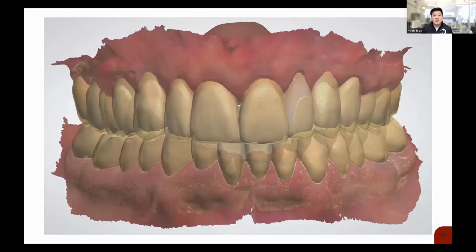Believe it or not, I spend the majority of my time in a day as a designer doing digital diagnostics. Again, in DSD, they have these protocols where they have two steps in one, where you can have a motivational mock-up, all these different types. If you're familiar with DSD, they have a bunch of different models. For my personal workflow, I like to incorporate as many of those models into a single one as possible. I think it makes it a little bit more efficient.